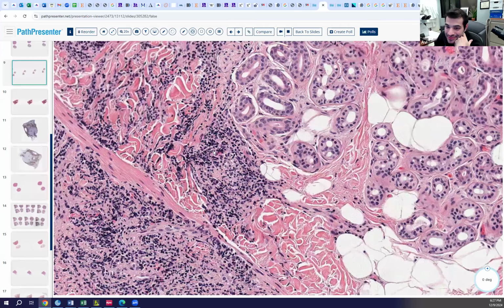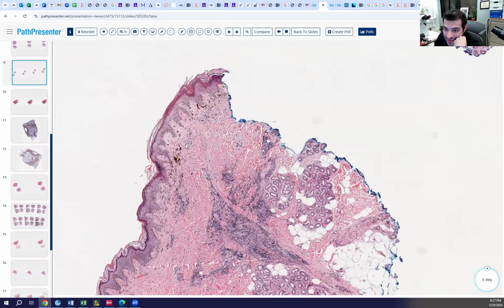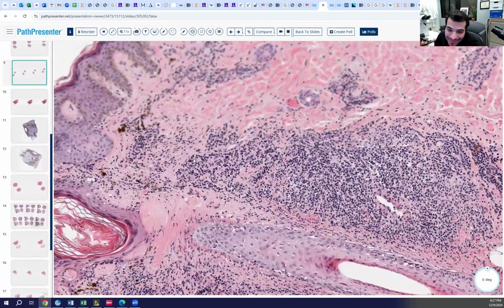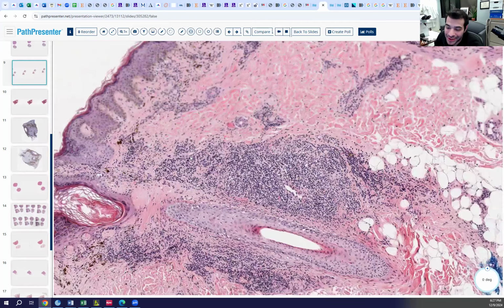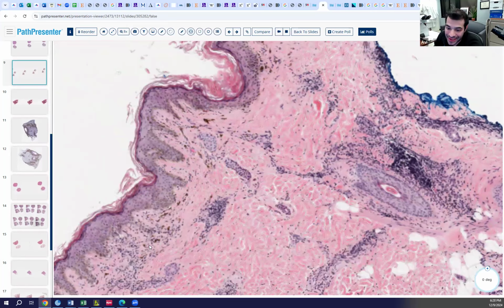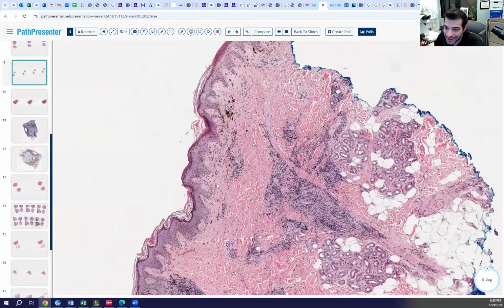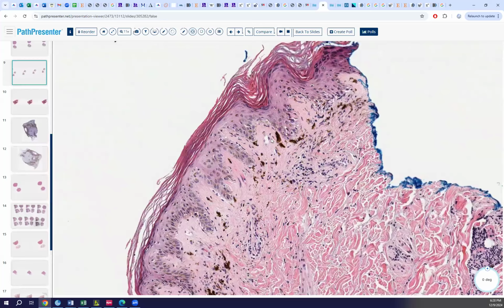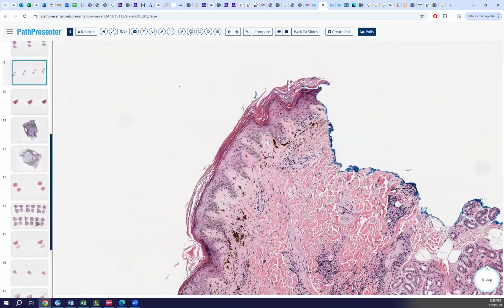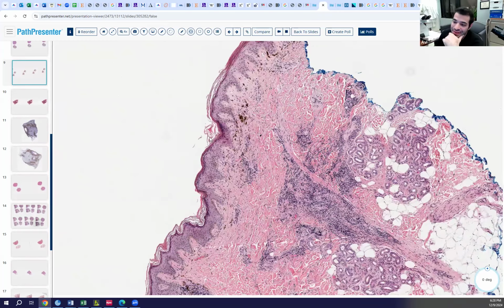And what cells are they? Lymphocytes. They're lymphocytes, jet black. Some people disagree, some people see blue. But anyway, when we see superficial and deep inflammation around adnexal structures with some changes reminiscent of an interface dermatitis, what's the number one thing that we're thinking of? LPP? Lichen planopilaris? DLE. Oh, like DLE. So would LPP have this?